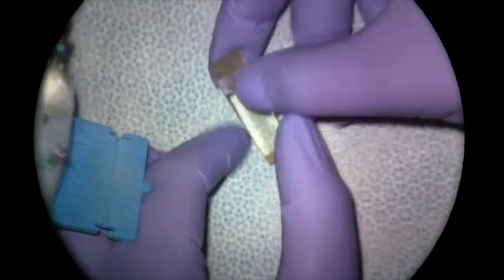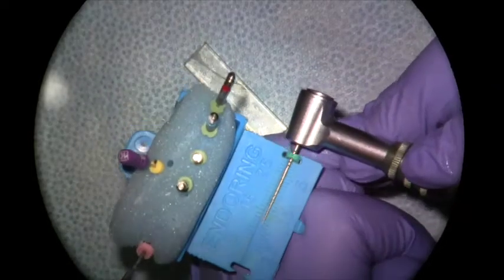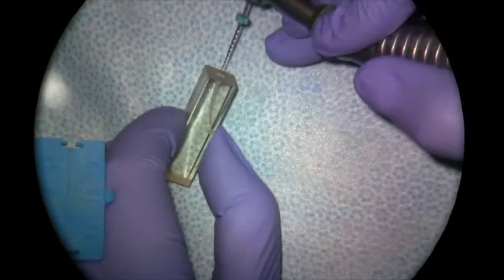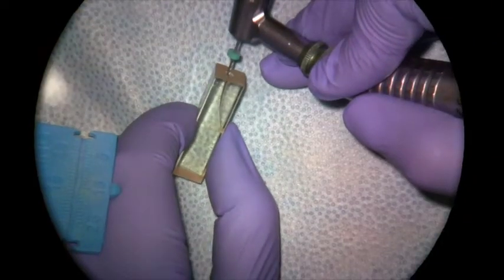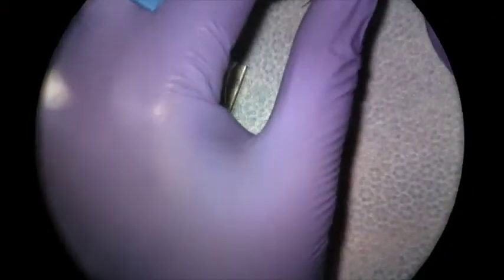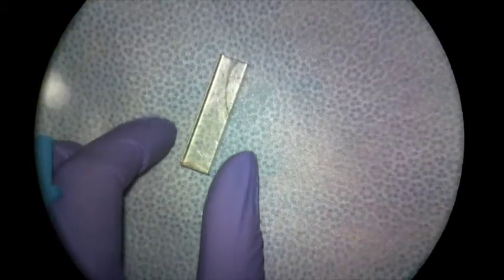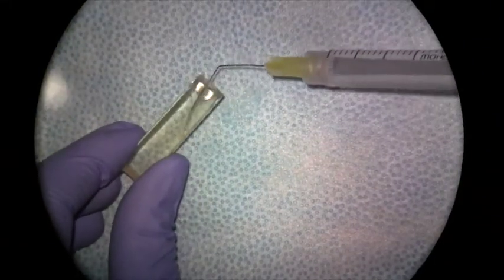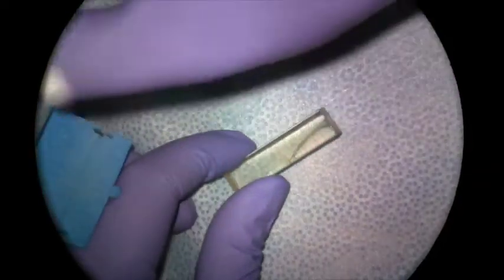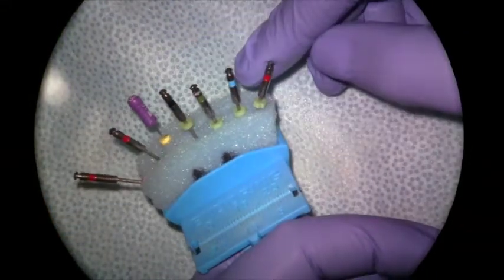I'm going to go a little bit deeper with the 25.08. Again, I'll measure this to my length so I know I'm not going beyond it, but this file is not expected to go all the way to your corrected working length. I'll place it in the canal until it binds — just an in-and-out motion with no real apical pressure to create that coronal space. Then I'll irrigate and recapitulate with my #10 file.